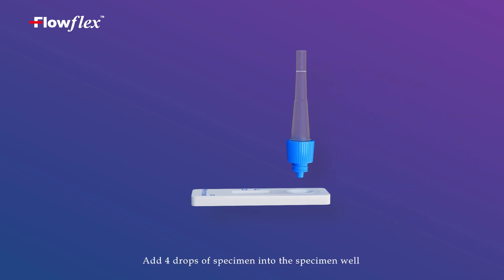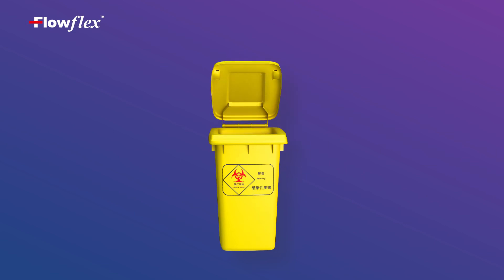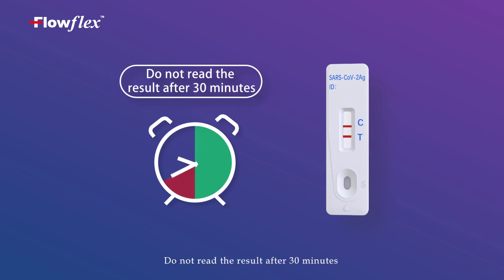Add 4 drops of specimen into the specimen well. Read the result at 15 to 30 minutes. Do not read the result after 30 minutes.